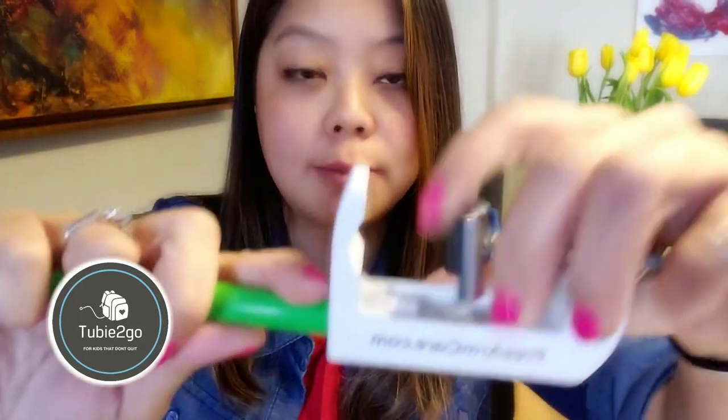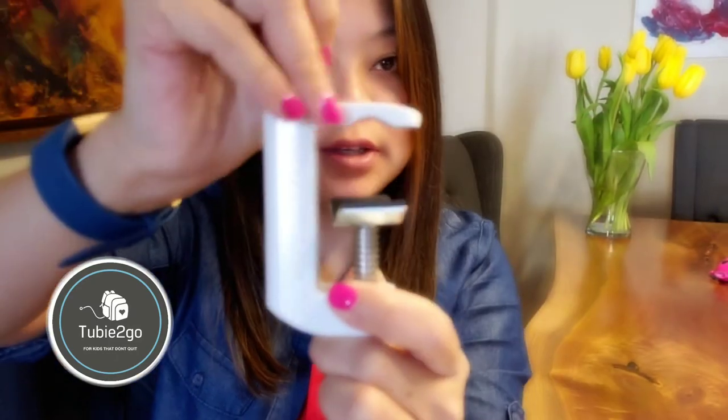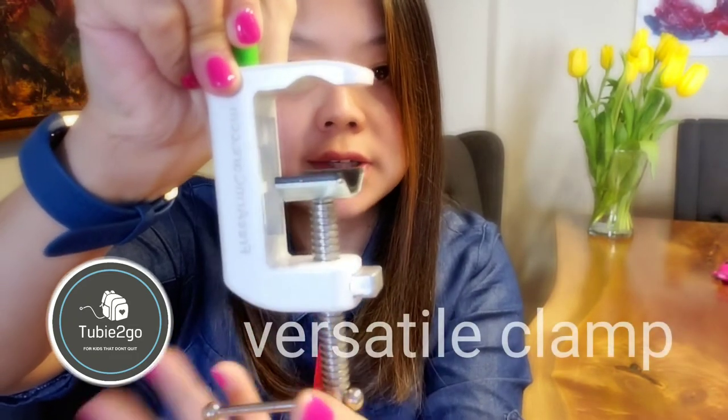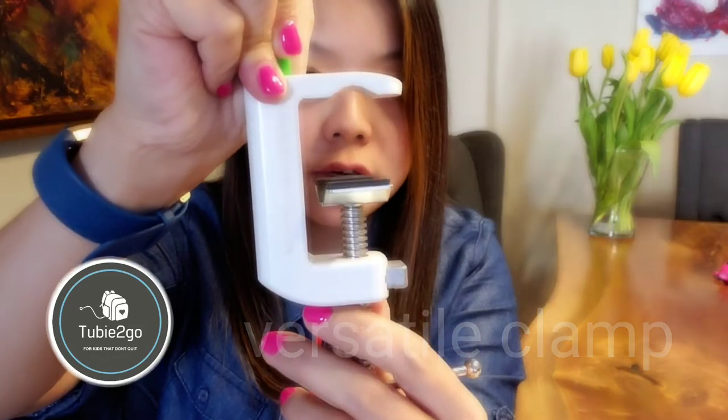Let me show you some of the great features. The first feature of the Free Arm that I like — probably the best about the product — and by the way, this is not paid advertising, this is just my honest share and feedback. The first feature I want to share is the clamp. This is the type of clamp used at the base of the Free Arm.